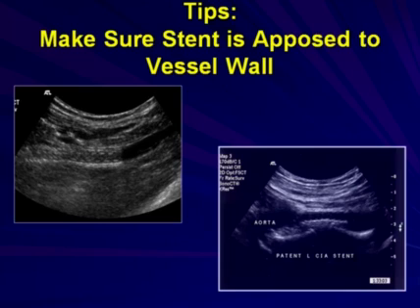Most stents in the United States are nitinol, and most stents in Europe currently today are stainless steel. Even though most stents that we see are nitinol, depending on what the manufacturer is and how the stents are put together, they do image quite differently. You can see that these two have a very different imaging profile, but they're generally pretty easy to see.